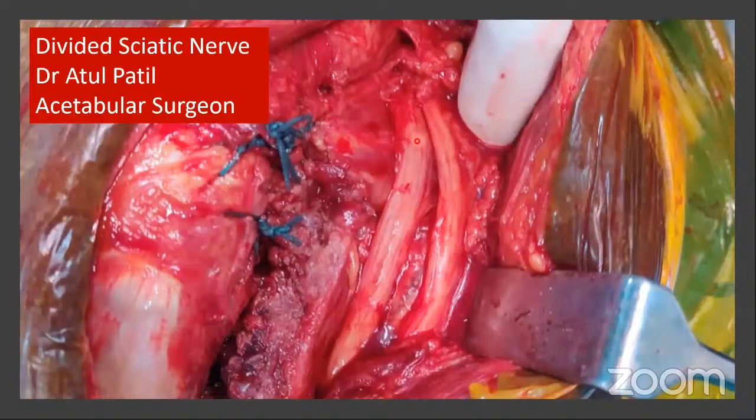Shailesh, in this particular case, this is our surgeon, Dr. Atul Patil, who dissected this for us. He quickly called me into the OT and said that we have got a bifid sciatic nerve. You can see that proximally. So sometimes if you place the needle maybe here somewhere, you may not be able to get the twitch. And that is the reason why with PNS, you need to keep on going either medial or lateral.